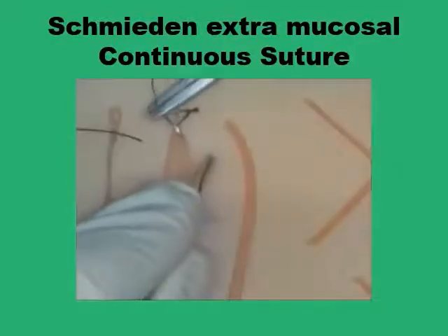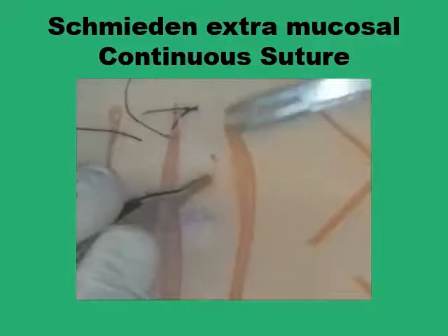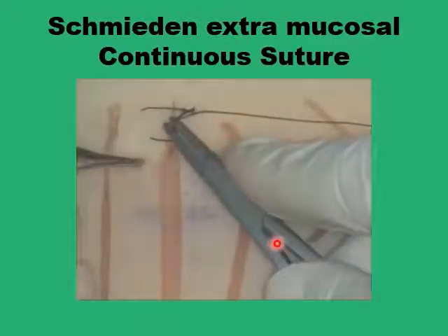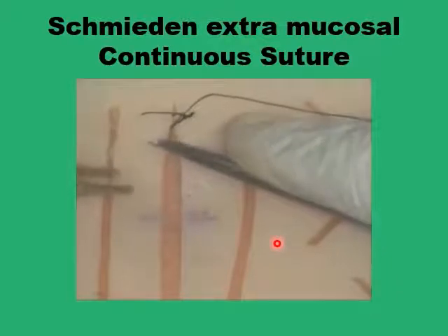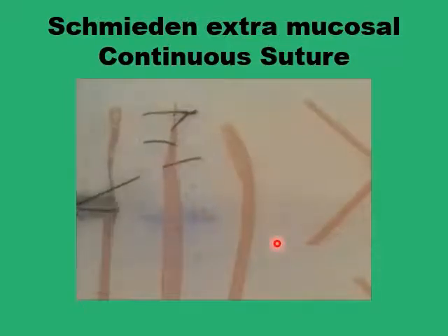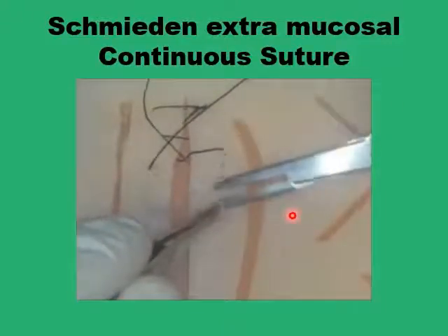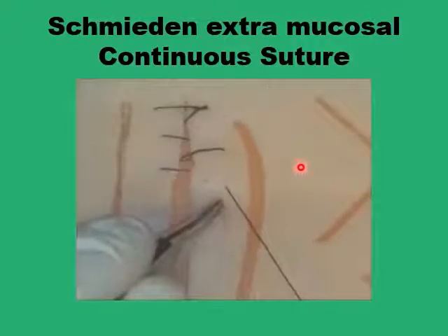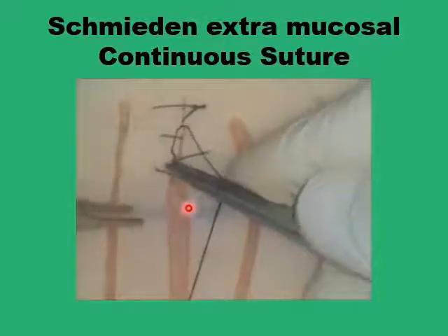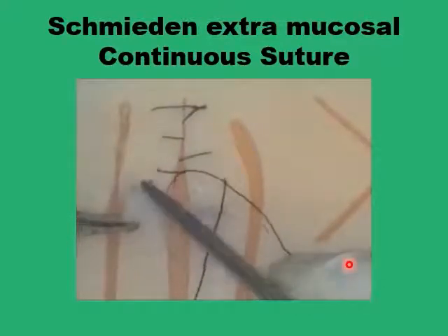Come out at the serosa, then repeat on the other side again sparing the mucosa, coming out at the serosa at the next level. You are going to repeat this until you reach the end of the wound, going from one level to the next diagonally. The suture strand left towards the surface on the serosa will be horizontal, while the suture underneath the wound is going to be diagonal between one level and the next.